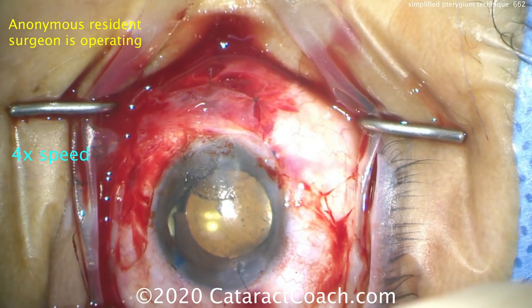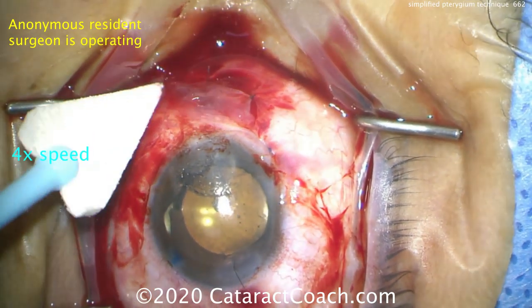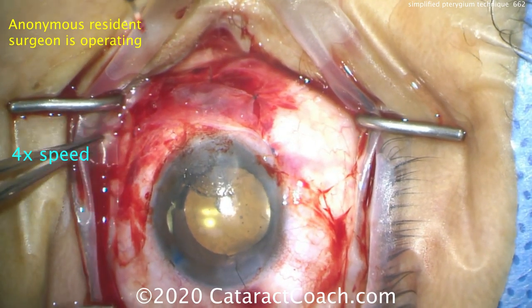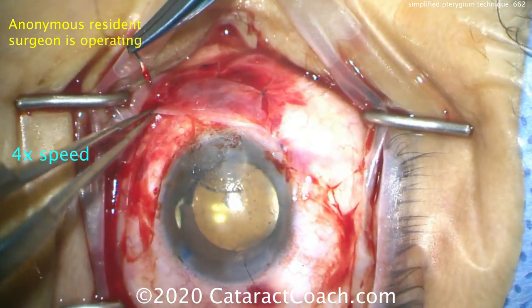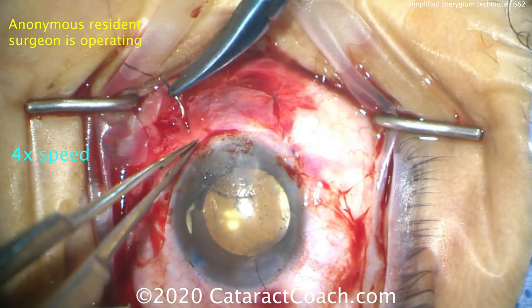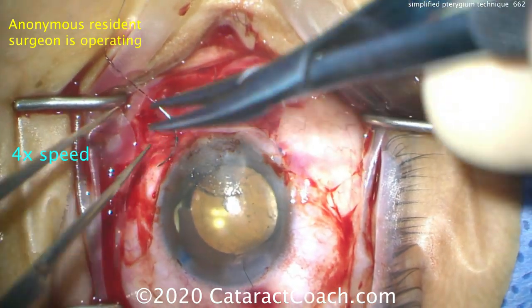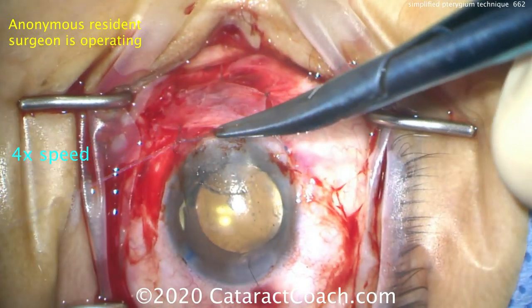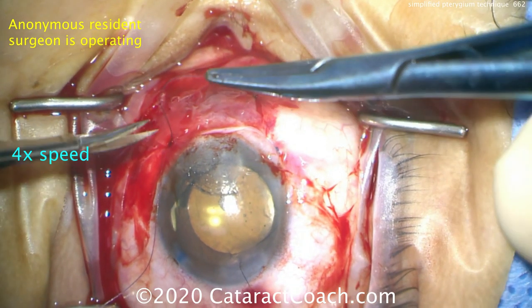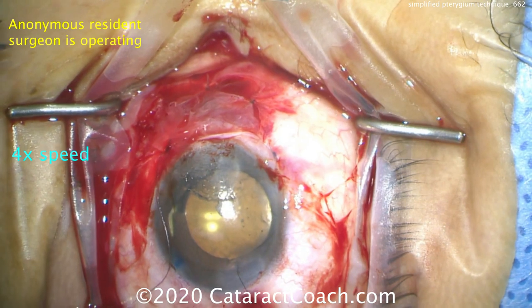Now what happens to the superior conjunctiva where you made that flap or took the rotational graft from? It'll epithelialize in. Because it's tucked up underneath the upper eyelid, it'll be very comfortable for the patient and will heal very nicely. You want any exposed conjunctiva — that's conjunctiva between the eyelids exposed to the environment — to be nicely in position with no bare sclera. These sutures go in quite nicely, and that's a beautiful result. The end — it's going to look great.